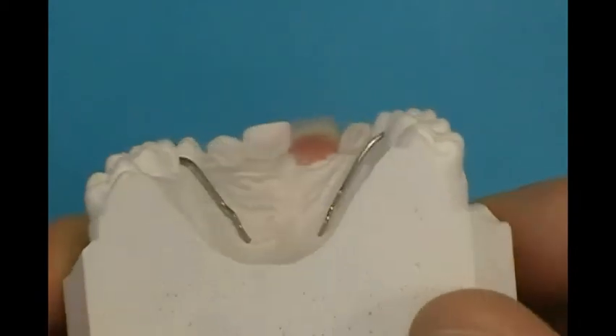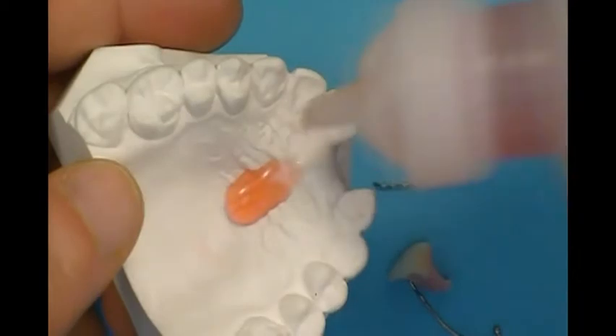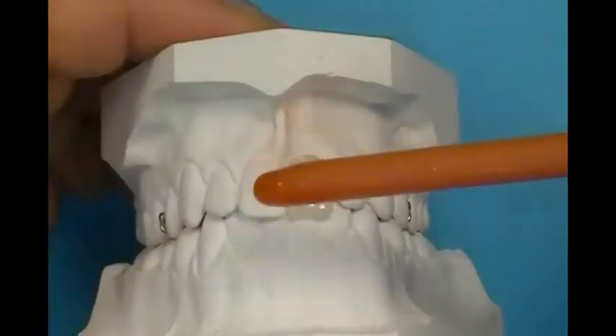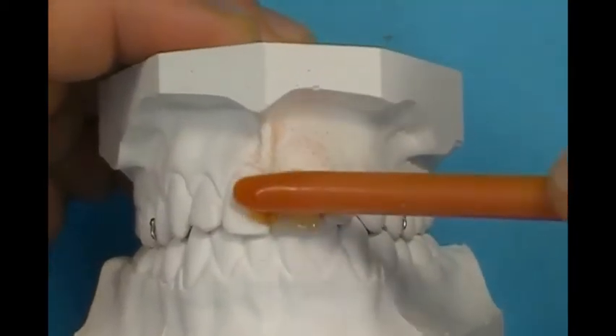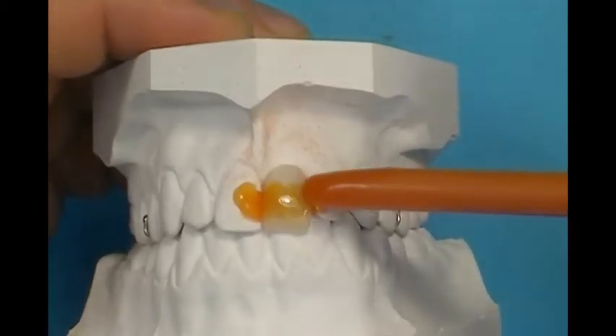The wire work is fabricated; clasp and labial bow designs can be made. Apply liquid separator to the model except along the facial surfaces where the wires will be waxed in place. Place the pontic on the model and secure its position with sticky wax on the facial surface. Also stabilize the wires to the model with sticky wax or hygienic base plate wax.